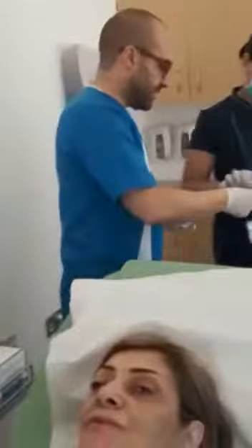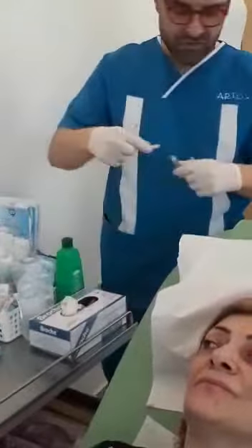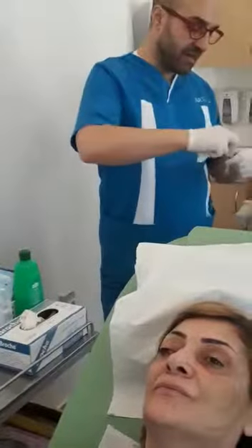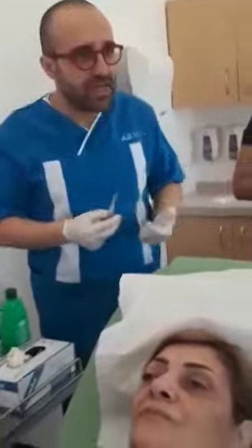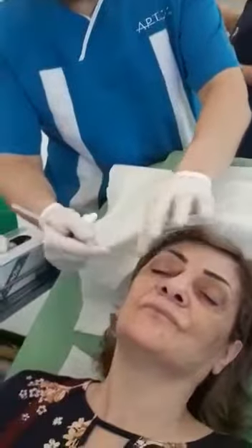A lot of patients and practitioners are scared because the threads are lasting a lot. Whatever, that's what we want. That's what we need in order to have some results. I'd be very glad to have a non-permanent thread, because the histology around the permanent thread is different. No cellular reaction, just fibrosis.